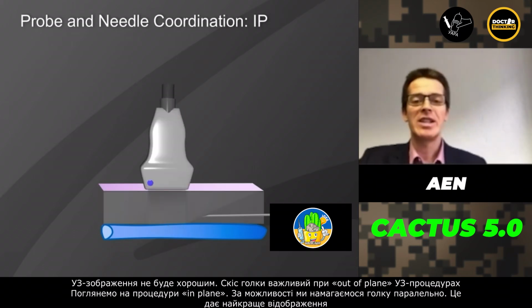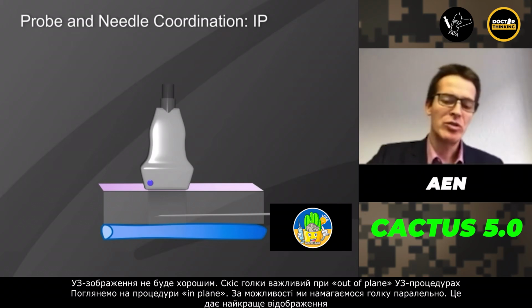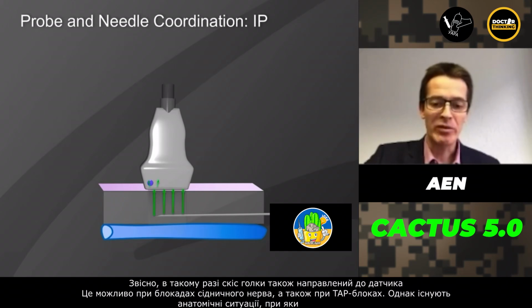Let's look at in-plane procedures. Whenever it is possible, we try to have a parallel needle path in relation to the footprint. This again creates good reflections of the sound waves back to the probe, and of course in this case the bevel is directed towards the probe too.